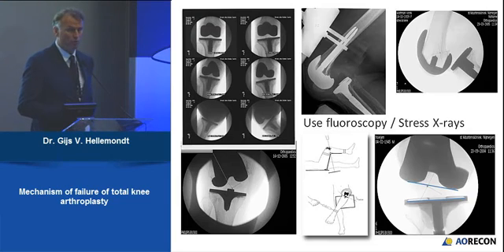Malposition, of course, is also a big issue. We've heard already this morning that sometimes it's not easy to align the knee properly. Most patients who have a malalignment or malpositioned knee, they have the problem that they have never been right. Often have a secondary stiffness or arthrofibrosis, and they claim they have a different position of the foot or leg postoperatively. And remember, it's possible in both the coronal, sagittal and axial plane or in combinations.